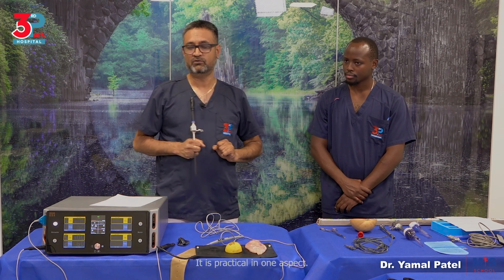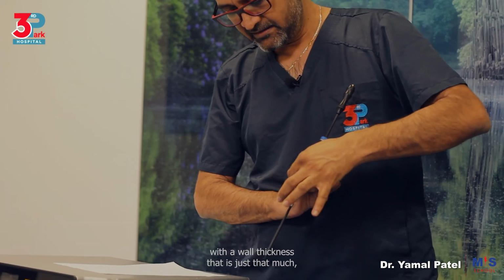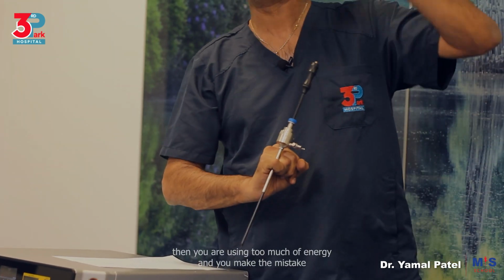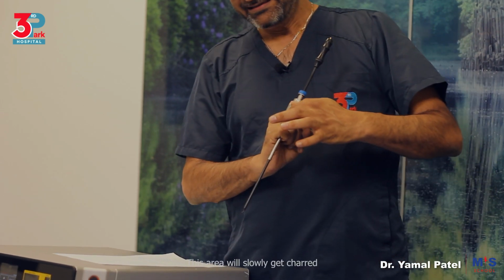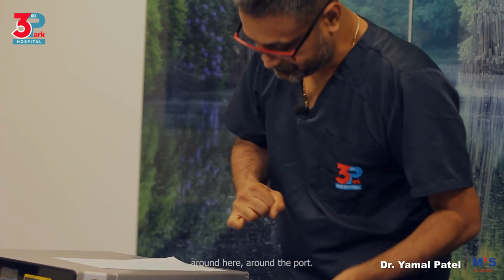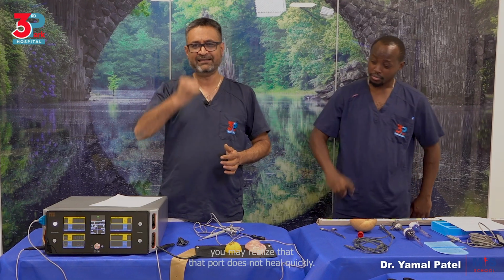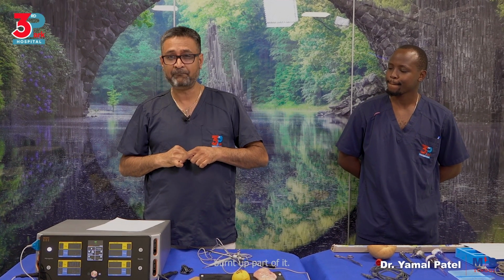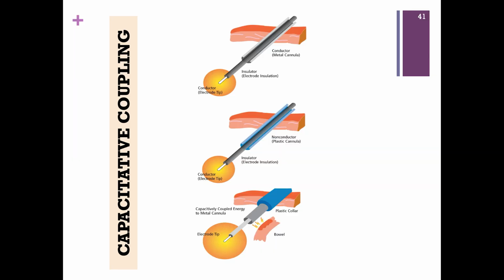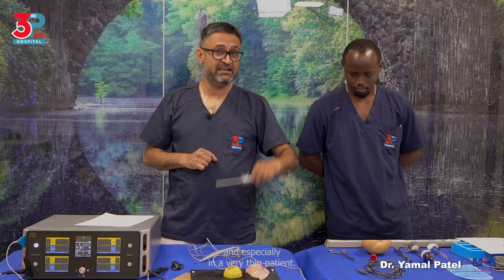But now, where is it practical? It is practical in one aspect. If you have a very thin patient with a wall thickness that is just that much, then you are using too much energy, and you make the mistake of using the blue, which is the high voltage. This area will slowly get charred around here, around the port. And then when you have finished the surgery and you seal this off, you may realize that that port does not heal quickly. It does not heal quickly because you've probably burnt up part of it and it is not now much viable tissue. So when you're trying to stitch it together, it won't heal that quickly. So that is a practical aspect about capacitive coupling, and especially in a very thin patient.